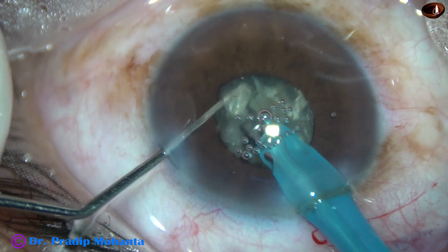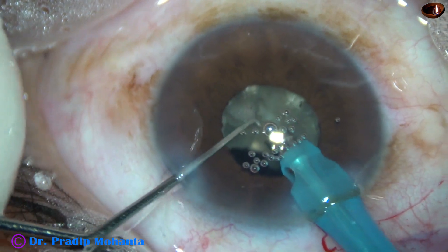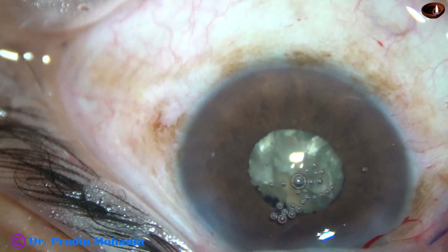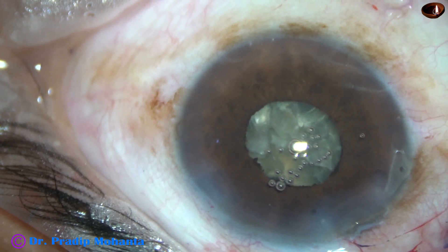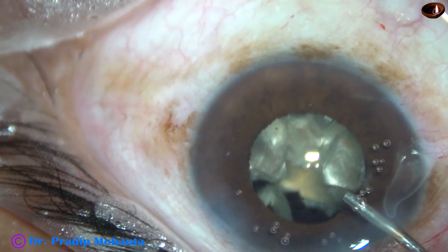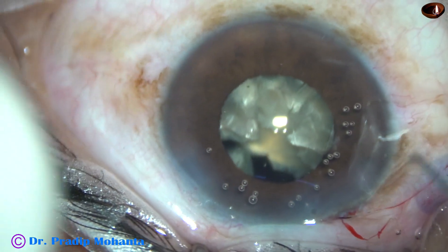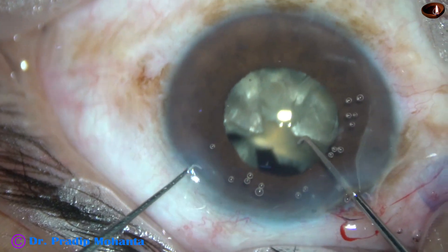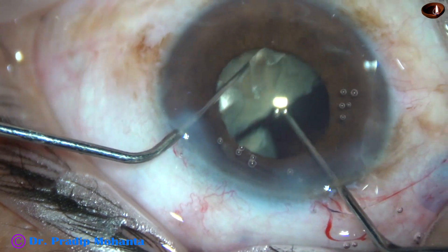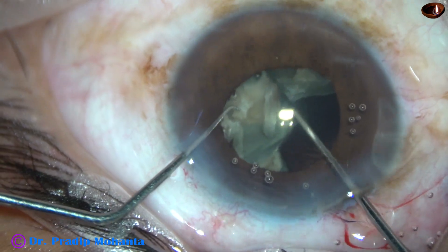I am trying to get at the edge and tilt it, but it didn't happen. Now is the time to come out, inject some viscoelastic, and manage this piece manually — do some manual work so that the surgery becomes safe. Inject some viscoelastic, the pupil dilates. And now I take a Sinski hook and my small chopper, go behind the piece, lift it off, and the pieces are separated completely.